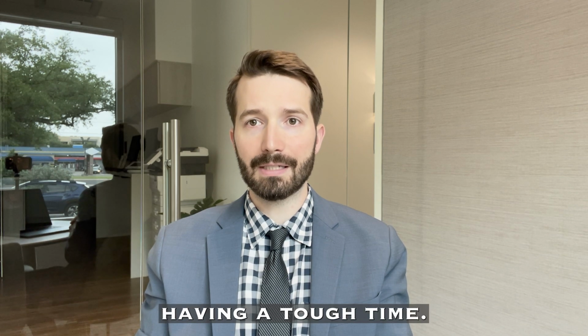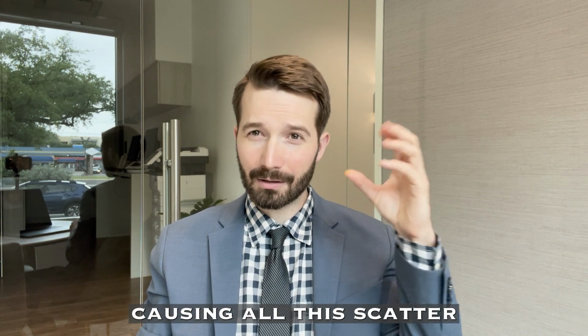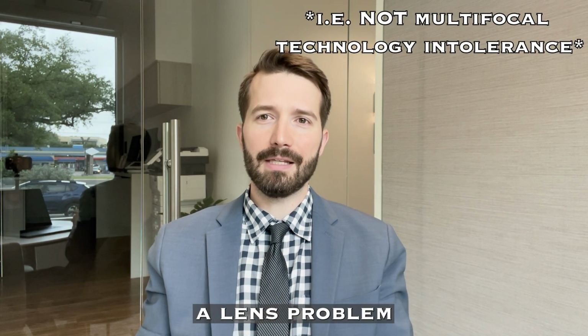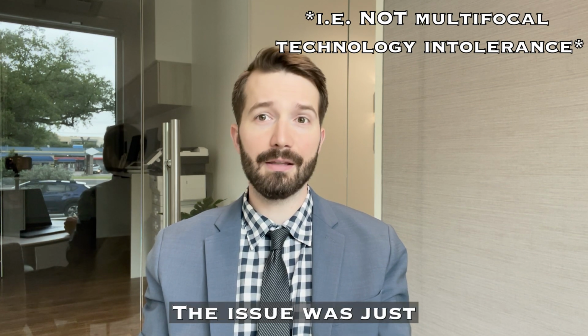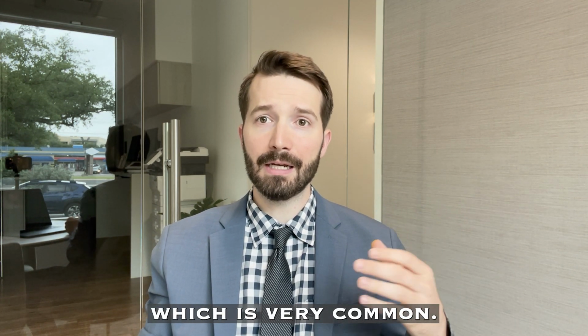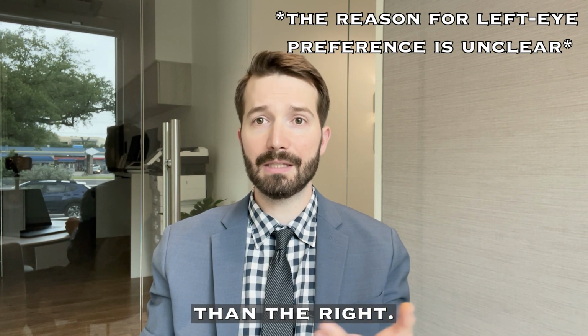And she was having a tough time being outdoors or being in bright environments because the light was causing all this scatter, and it was very bothersome to her. So I knew it wasn't a lens problem in and of itself. She liked the Odyssey lens in her right eye. The issue was just some scatter effect that she was getting on the left, which is very common. I've seen this and others have too, where the left eye tends to get more dysphotopsias than the right.